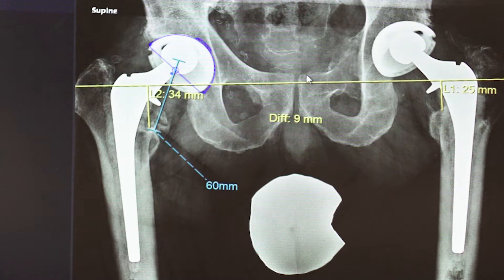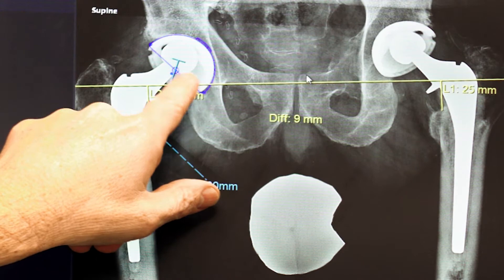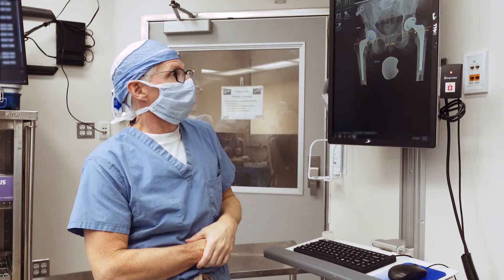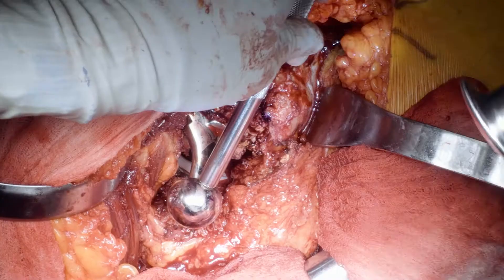The femoral component appears to be well fixed — it's cemented. There may be a little bit of osteolysis proximally, but really not a whole lot. The acetabular component is also well fixed, but you can see the eccentricity of the femoral head in the socket, and that often leads to catastrophic failure if you don't get this bad poly out.